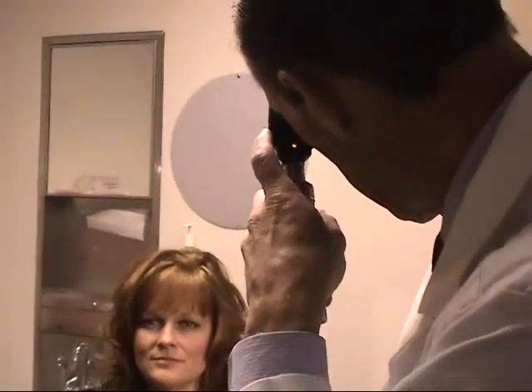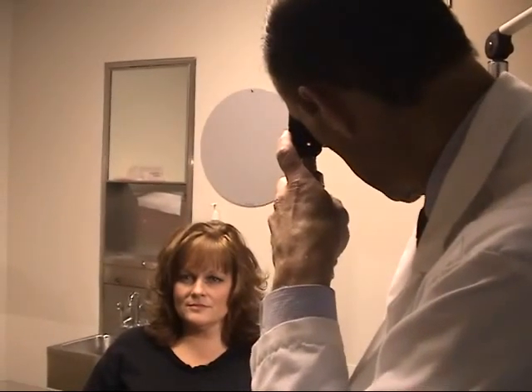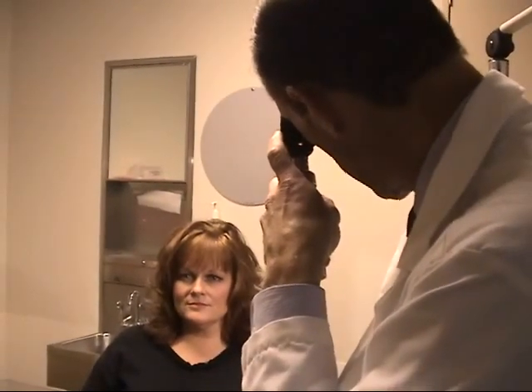Hold the ophthalmoscope in your right hand to examine the right eye, and in your left hand to examine the left eye. From a far away distance, shine the light in each pupil in turn to check for a red reflex.